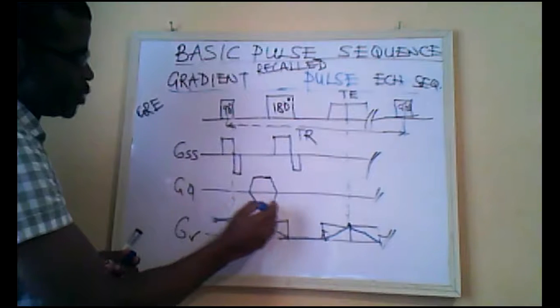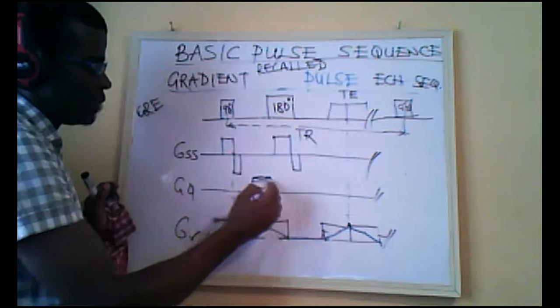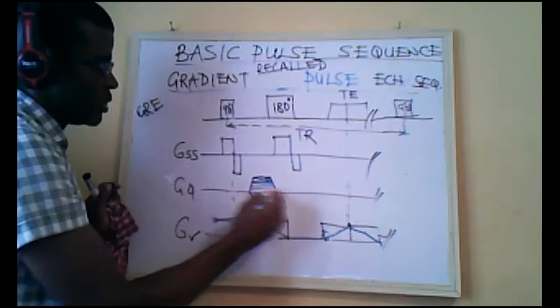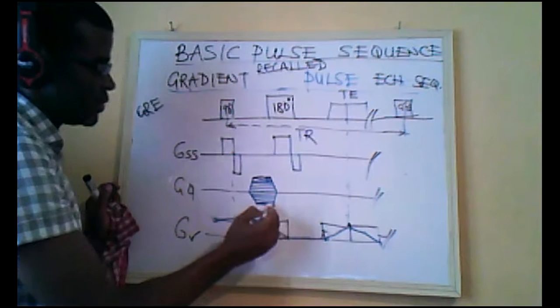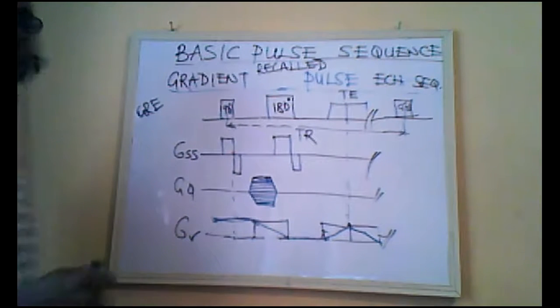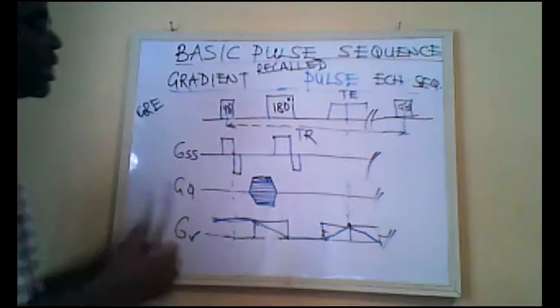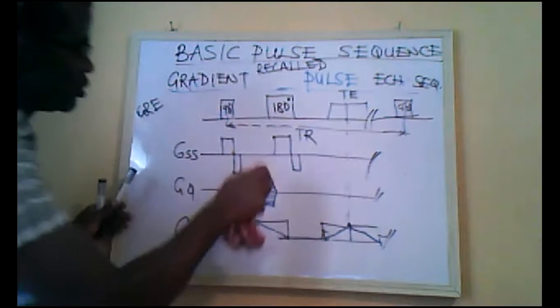I didn't fill up this space in the initial one. Of course, this continues for a very long time, continually iterating at different frequency levels, at different phases, until one fills up the k-space. Then one would have succeeded in acquiring one image. Then one goes on to do some other things.